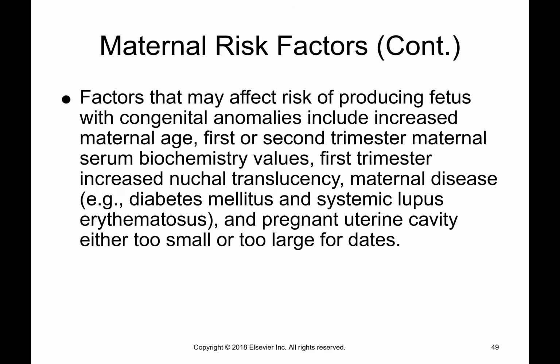I would do the same heart views, but I might pay a little bit more attention to the heart in a patient that has type 1 diabetes, and maybe take some more views of the heart in different ways just to make sure, because they have a higher chance of that. So knowing those kinds of things before you go in and start scanning is a huge thing.